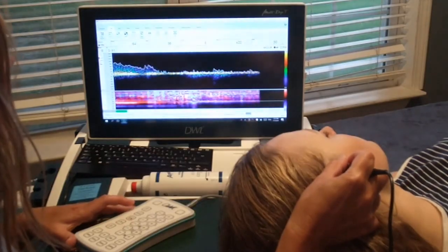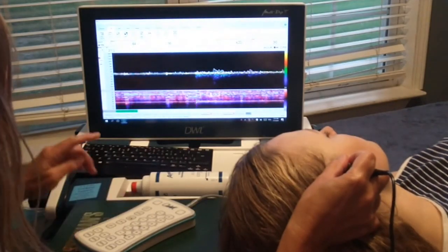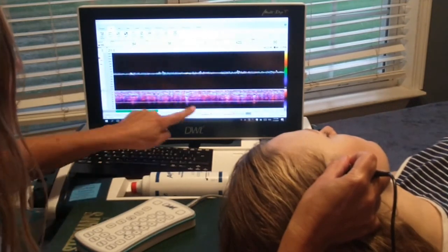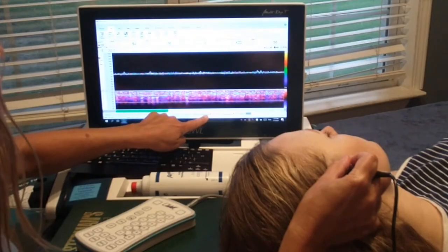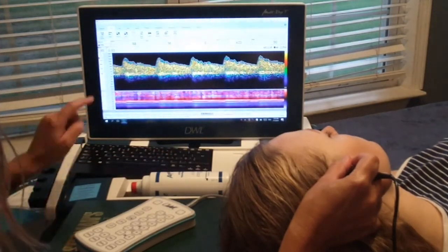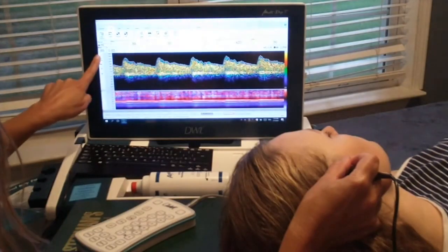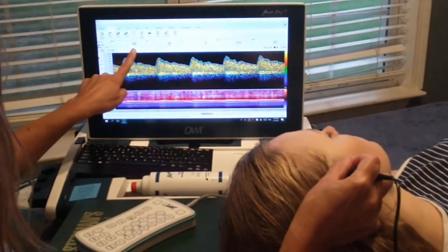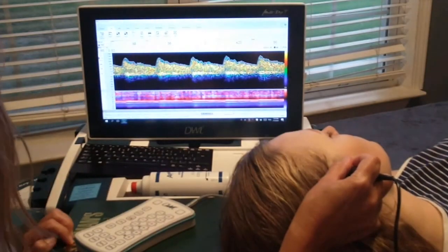And then you're going to want to go back to your highest mean velocity. To see what your highest mean velocity was, you'll find the red box around your highest mean, and you'll select that. You'll see at a depth of 58, you have the highest mean of 85. So you'll go back to the depth of 58 and aim for a high mean of 85.